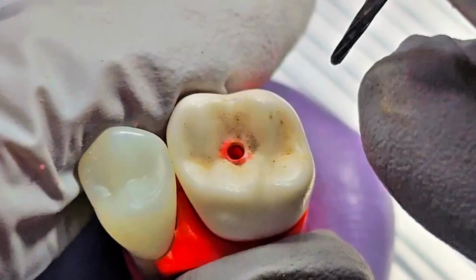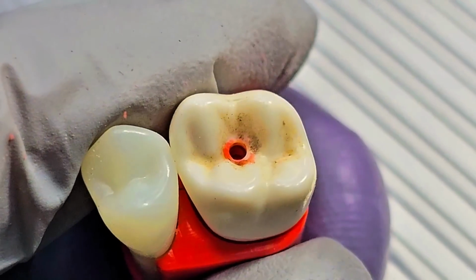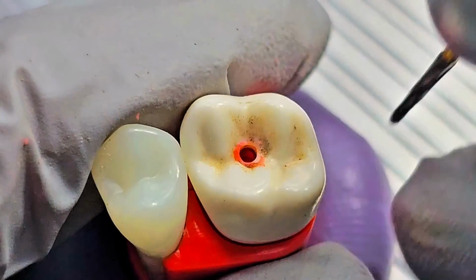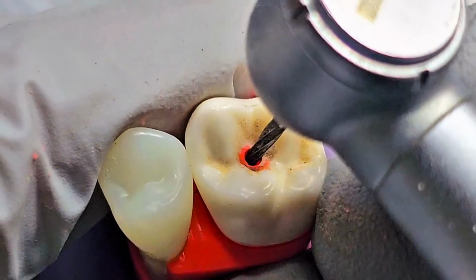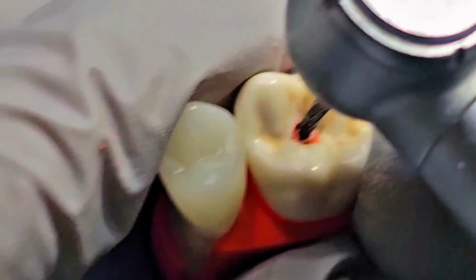Do you see that? Now we are into the pulp. I was in the pulp using the round burr, and now I see the pulp tissue, which is the wax, coming out.